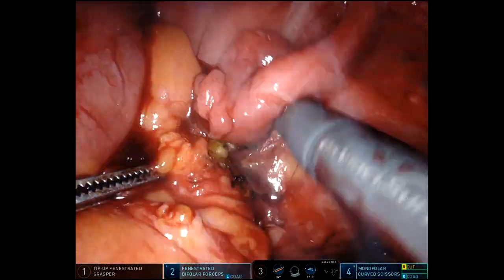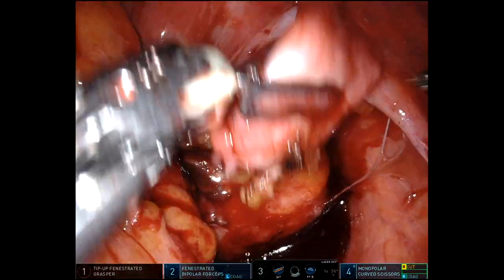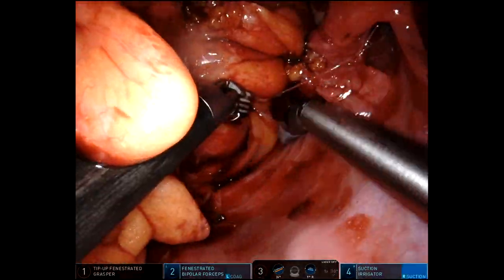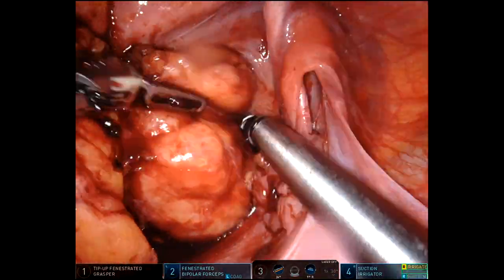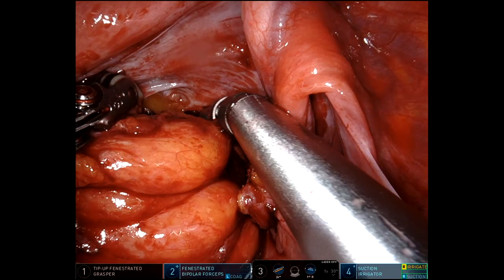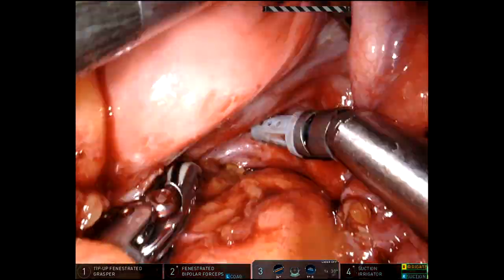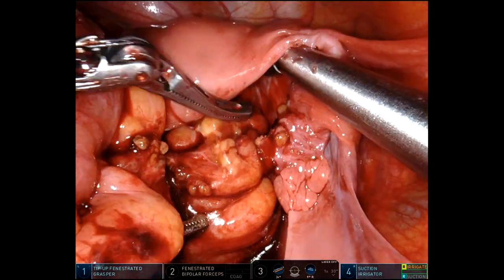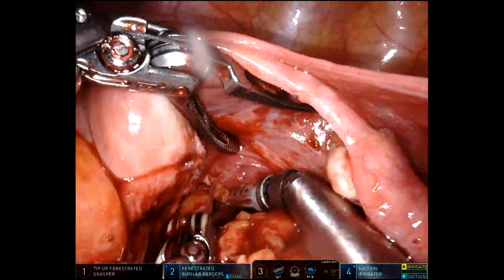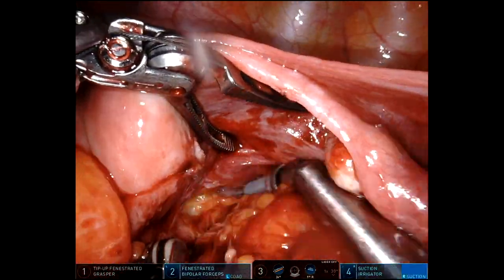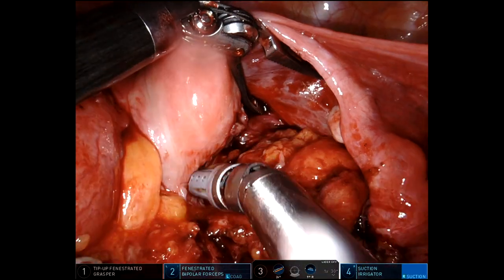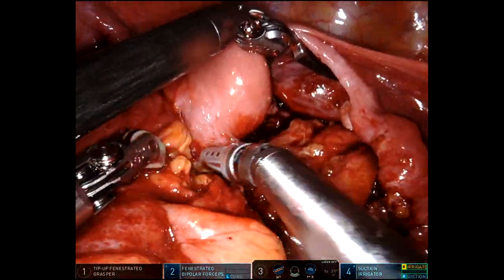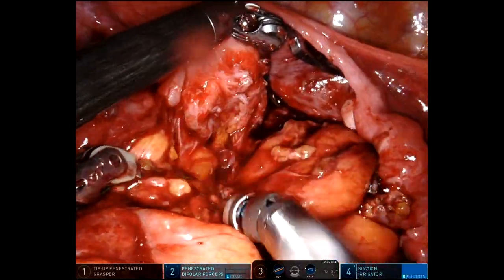Because it got really stuck there, I decided to do some pelvic dissection. I freed the right tube and ovary. There's a loop of sigmoid stuck way down deep into the pelvis, really adherent to the back of the uterus and the cervix. Having a lot of trouble with that part of the dissection, so I'm working bluntly with the suction device, which works nicely.